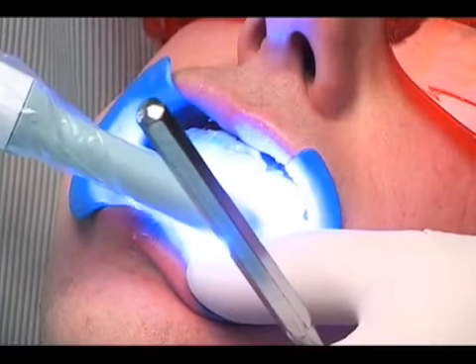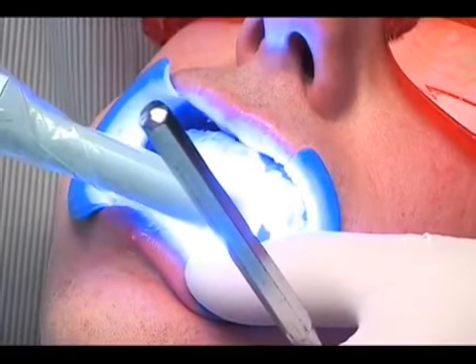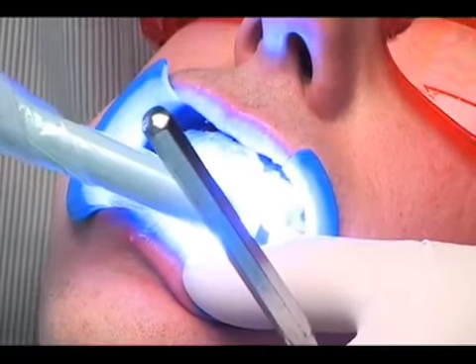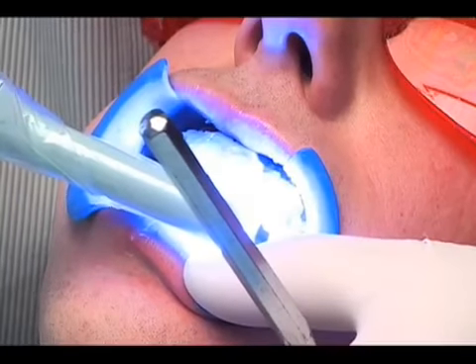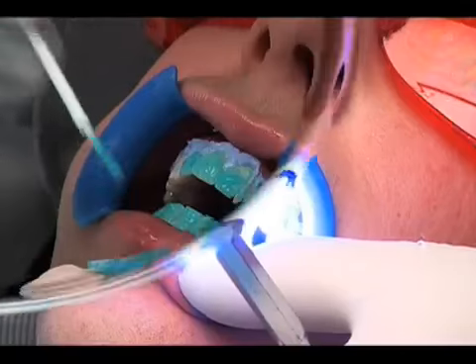Please note, the end result will be the same with or without the use of a bleaching light. However, the treatment time may be shortened when using one. After this time, suction off the gel with a high-speed evacuator. Do not rinse the gel from the teeth.